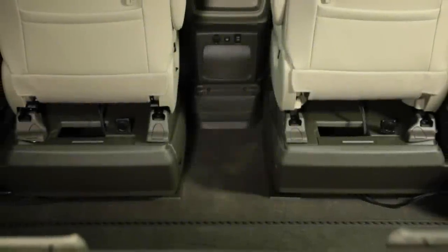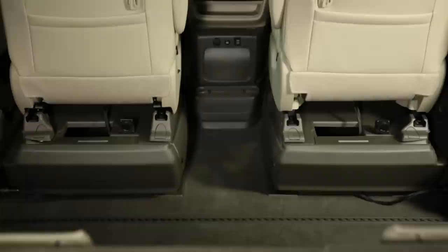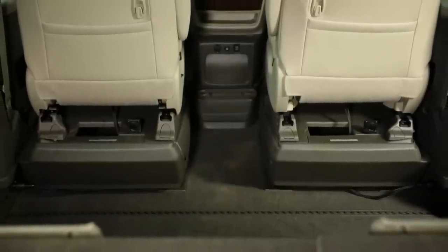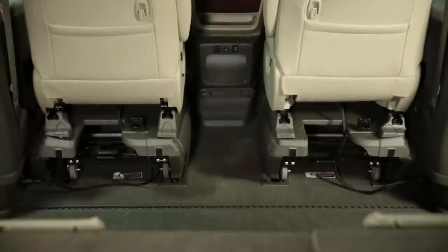Just like every BraunAbility feature, Step and Roll Seating is designed to blend into the rest of the vehicle. As you can see, seat base covers are offered to hide the pedals. You can use them to keep this clean look, or remove them if you'd like some extra space.